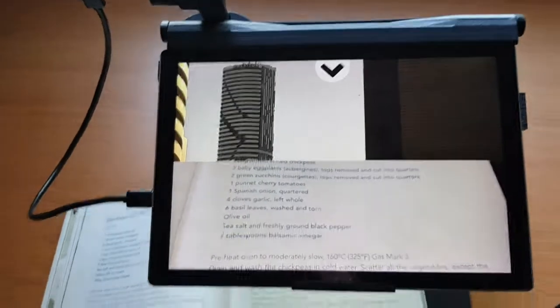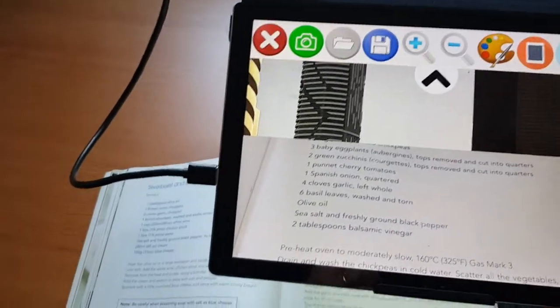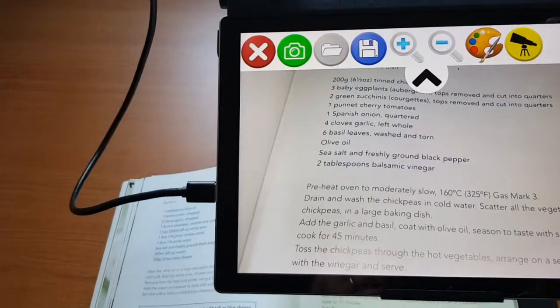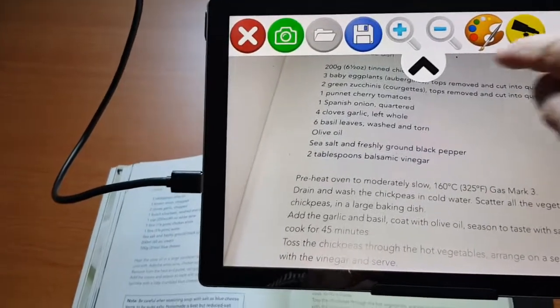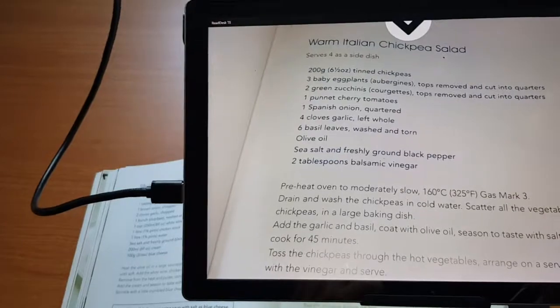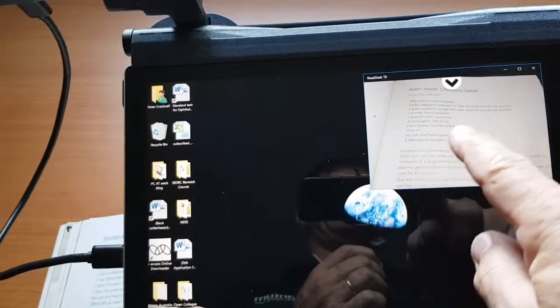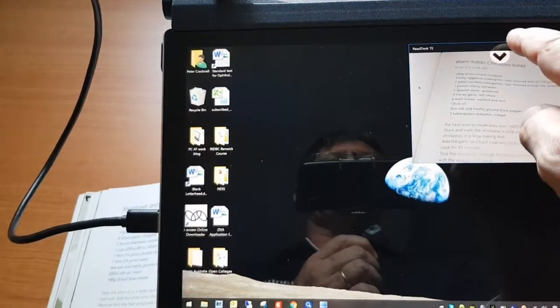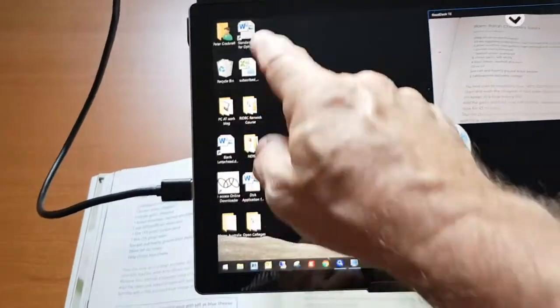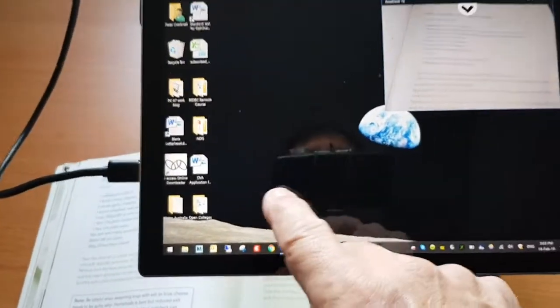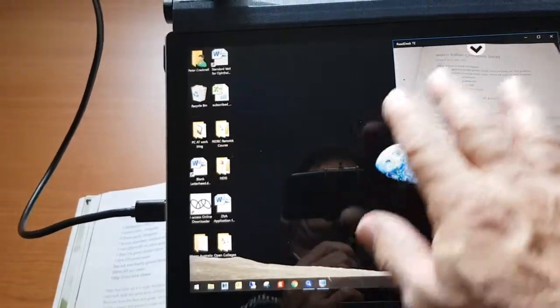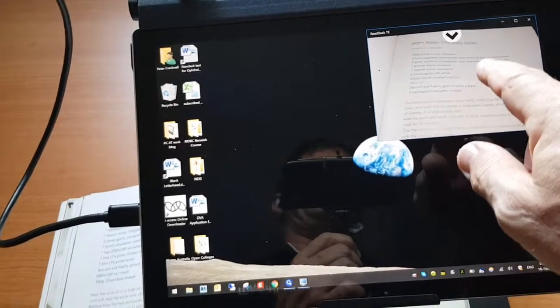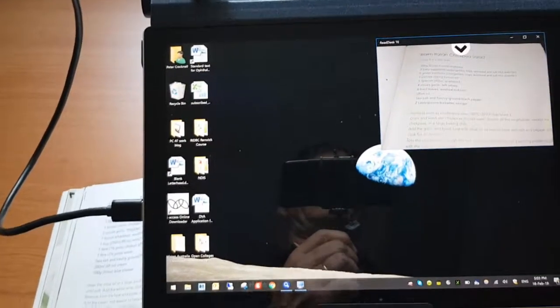It's also possible to make all of this, I'm just going to make it, let's say just, I'll go back to just the textbook at the moment. We can also make the whole lot a window as well. So here what I've done is I've made the electronic magnifier software, the ReadDesk software, a window within Windows, which means we can run, say, Microsoft Word. We could be running ZoomText or some other screen magnification software and we could still have in the corner a portion of it being, of course, the cameras and so on.